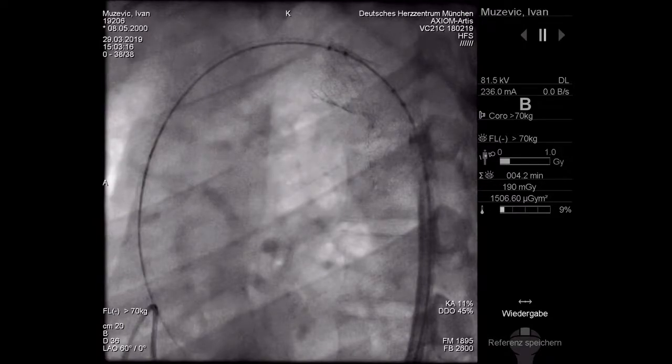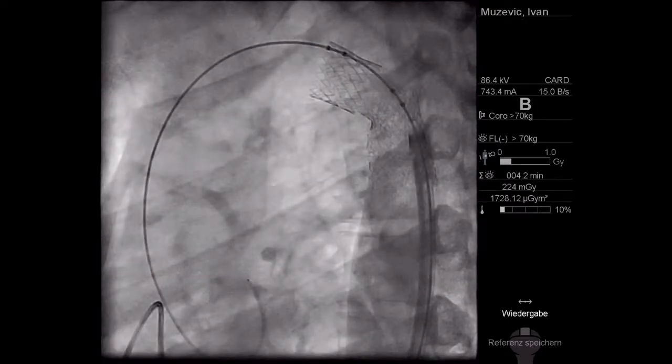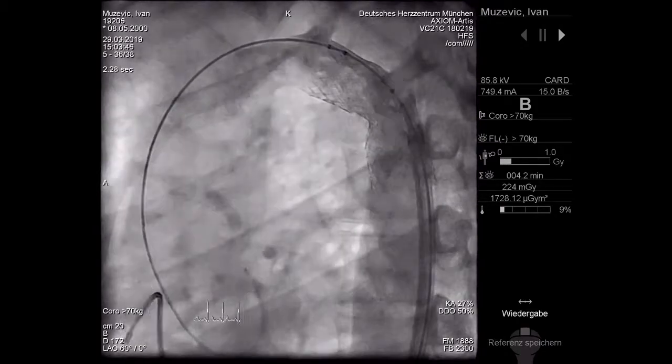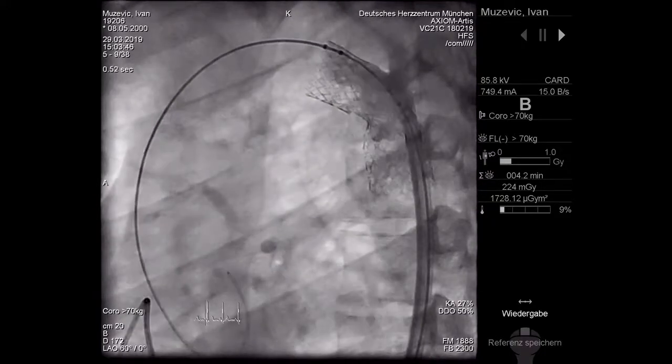I wanted to ask you, what kind of stent did you choose and why? This is a Max LD, 16 millimeter in length. I think this is a bare metal stent which can get to large diameters and is short. And there are not many short, large stents. And the balloon size, the diameter of the BIB was 16. Obviously, the advantage of an open cell design stent is that if it was in a position that wasn't perfect, you can reopen the side branch.